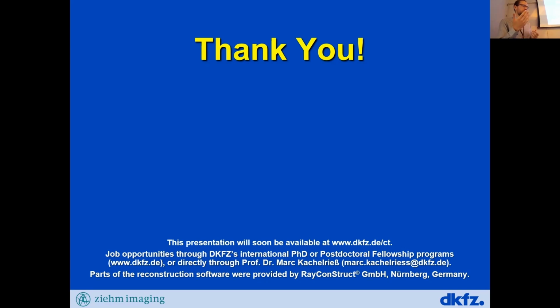In fact, if you look at such a projection, you don't see the tool anymore. So then you really need to use some temporal information from previous projections where there was not a lateral projection, but a more favorable one with less attenuation. Thank you. Let's thank the speaker again.